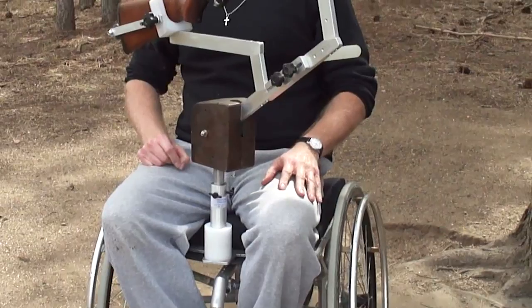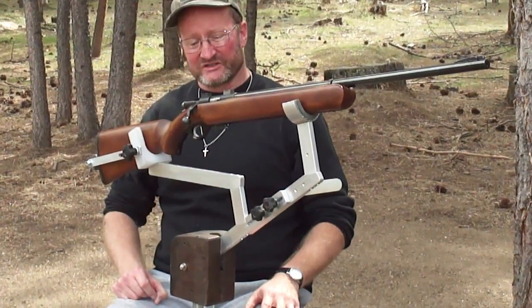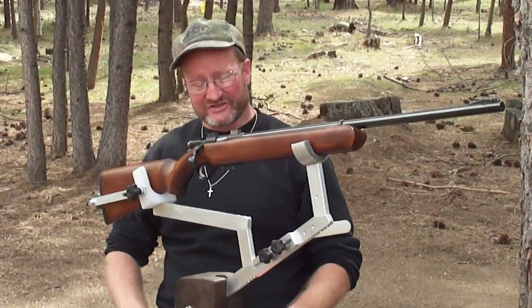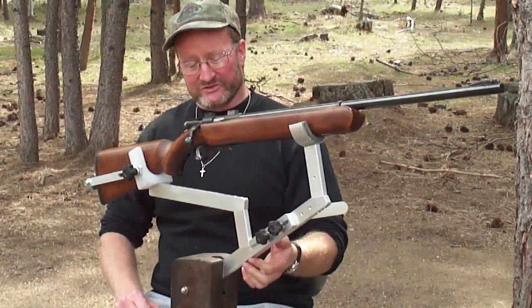This dial here is for semi-quadriplegics. For paraplegics, if necessary, remove this back portion here with two screws.